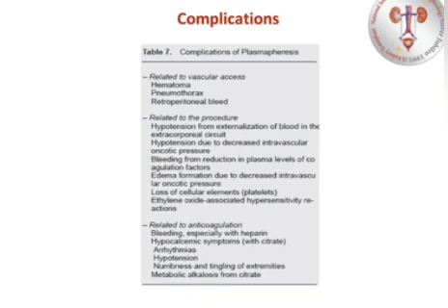That's again an important thing when we choose the plasma filter size, because as we said, the small size fits the small individual. So you cannot put a large size for a tiny individual, because the blood that you will take off from the patient will be large enough to cause hypotension. So this is an important thing.